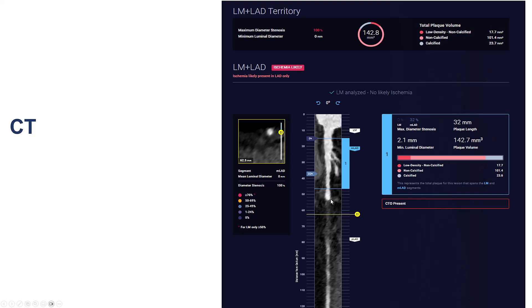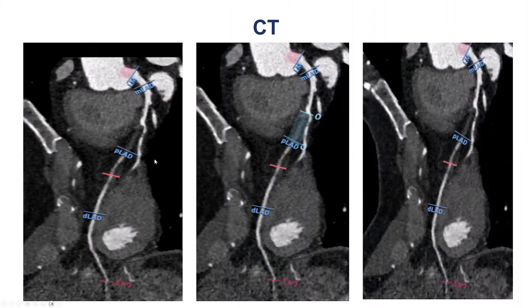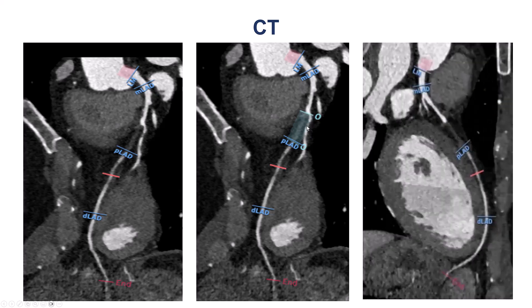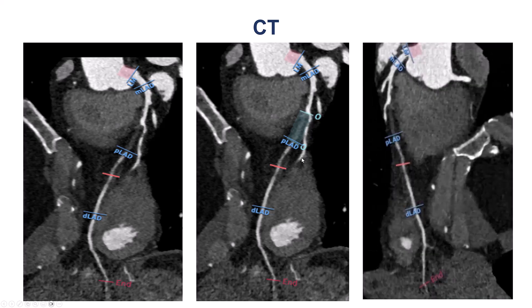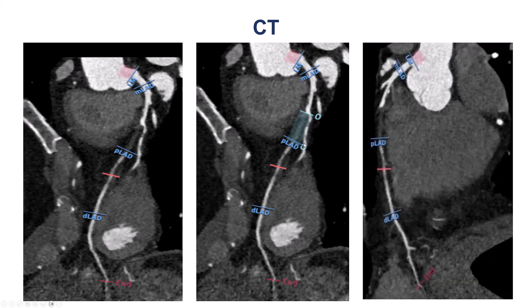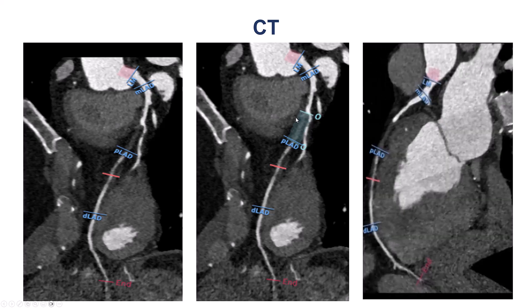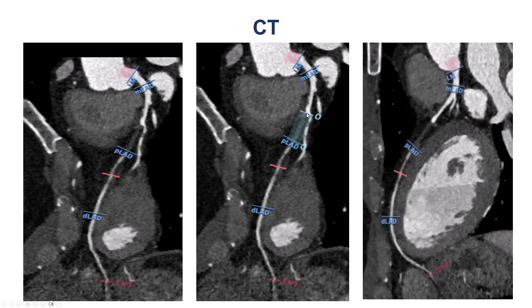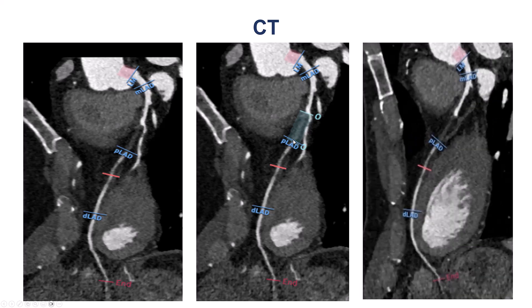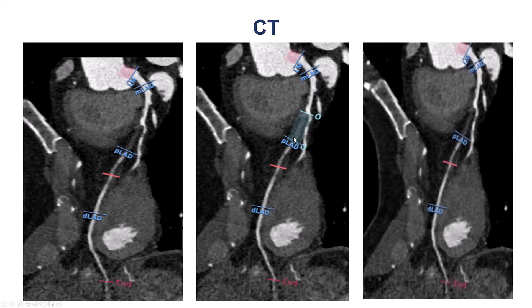Looking at a different software, the ClearLy software, we have the LAD CTO — it is soft plaque, and the CTO is located just after the takeoff of the diagonal branch. The software automatically detects the CTO and provides the length.